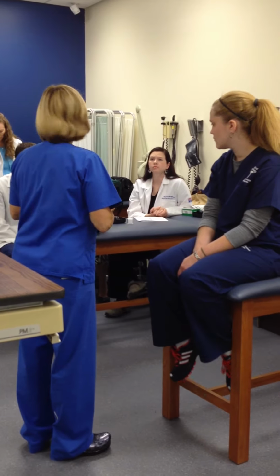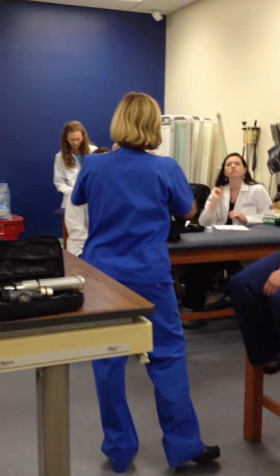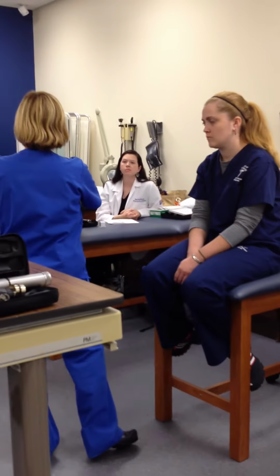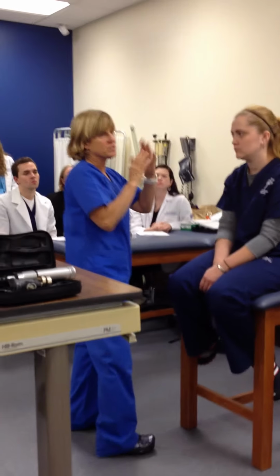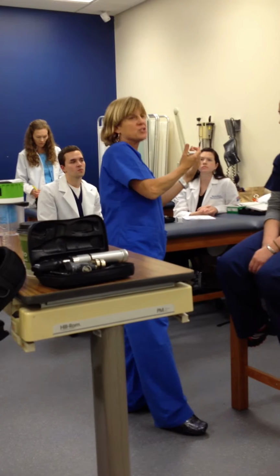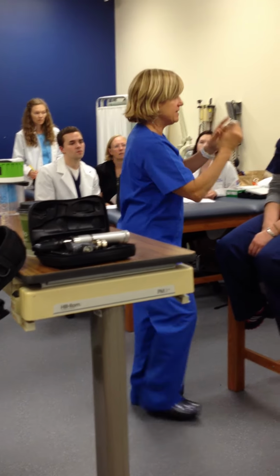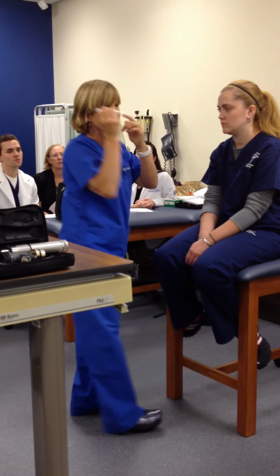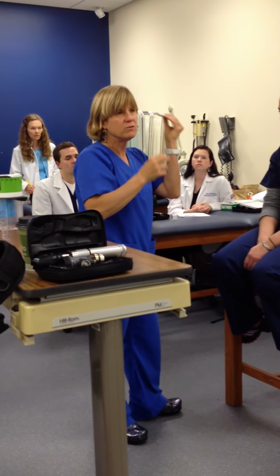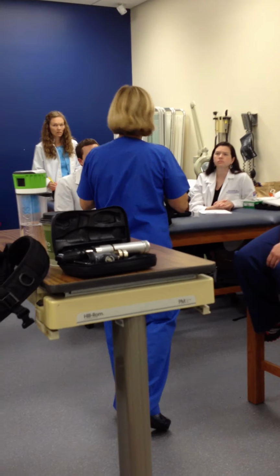Yes, of course, because the anterior chamber covers that iris. The iris is kind of behind it, but it's that chamber that is narrow and casting a shadow, so you're looking in the area of the iris. It would happen if I did it this way, we'd cast a shadow, it's just hard to get in there because the nose is there. That's why we do it from the outside here, to cast a shadow on the opposite side, okay?